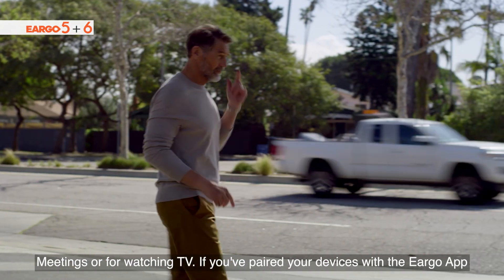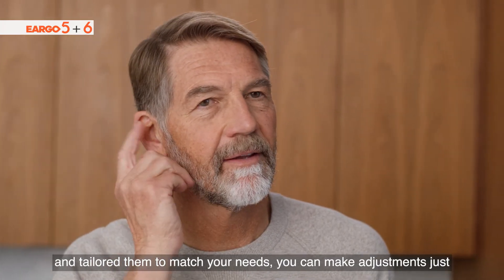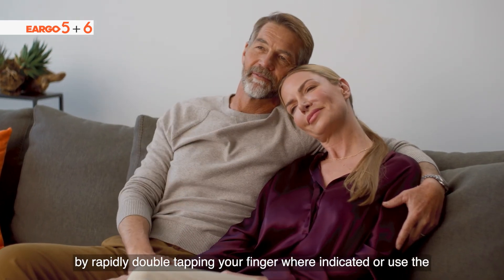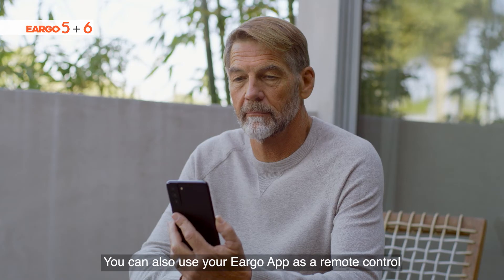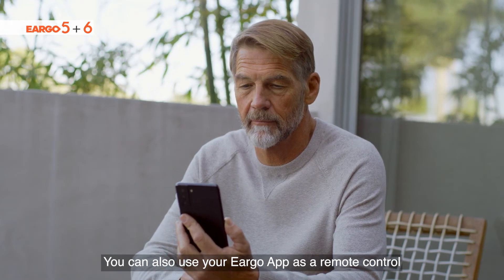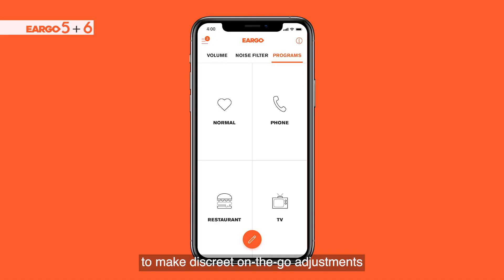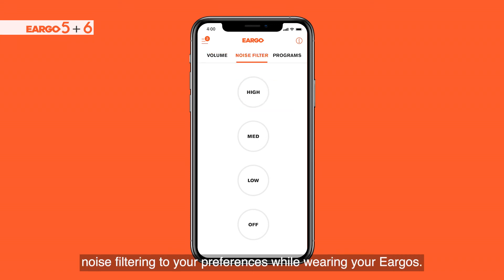If you've paired your devices with the Eargo app and tailored them to match your needs, you can make adjustments just by rapidly double tapping your finger where indicated, or use the Eargo app's program screen. You can also use the Eargo app as a remote control to make discrete on-the-go adjustments, change the program, and adjust the volume or the noise filtering to your preferences while wearing your Eargos.